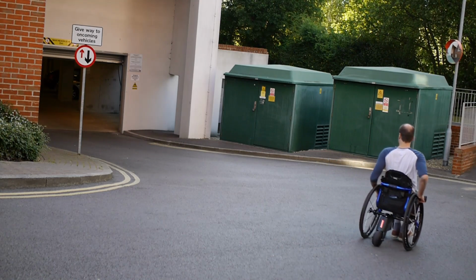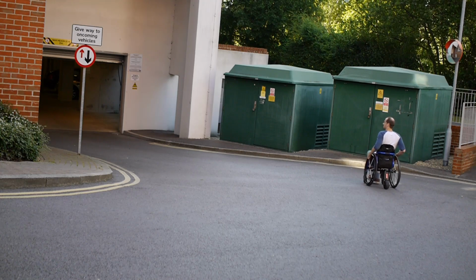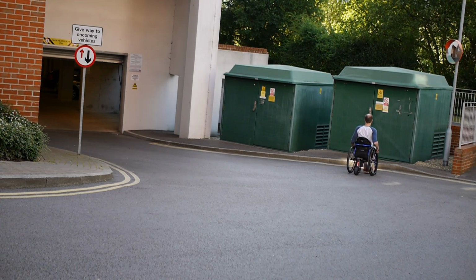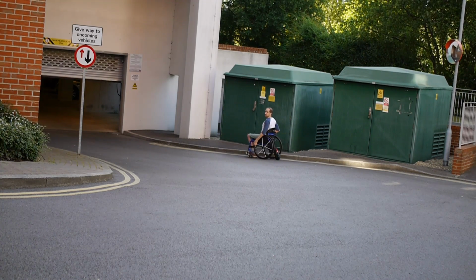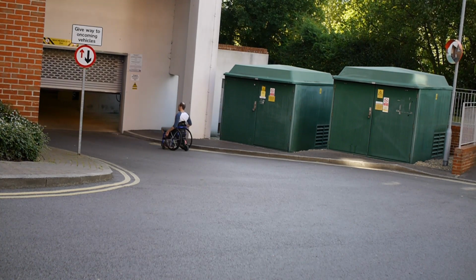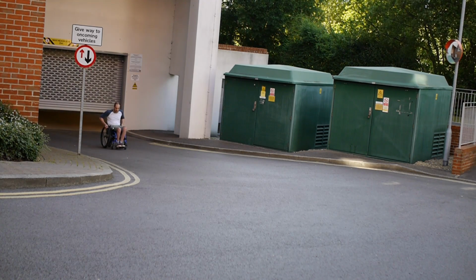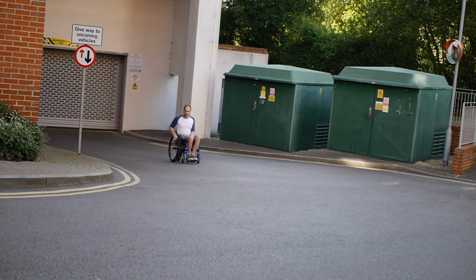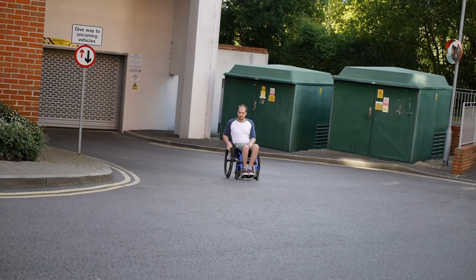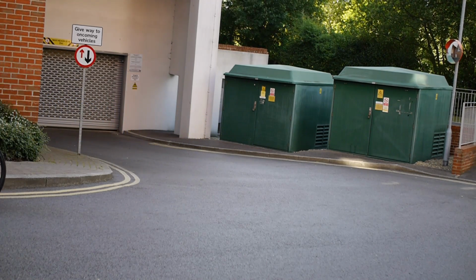And also I thought the next bit is that I'm probably going to need gloves with this. When you're pushing the wheelchair, slowing down, if you've got hands that work, then I don't think that's going to be an issue as such. But pushing, slowing down and steering the wheelchair, because when you've got this going, you're kind of more steering it rather than actually moving it, if that makes sense. So you're steering it with the wheels like you would if you were in a wheelchair, kind of like if you were going downhill. So I think a pair of gloves or something just to slip over the thumbs, just to protect those a bit, is something that I'm going to have to look into.